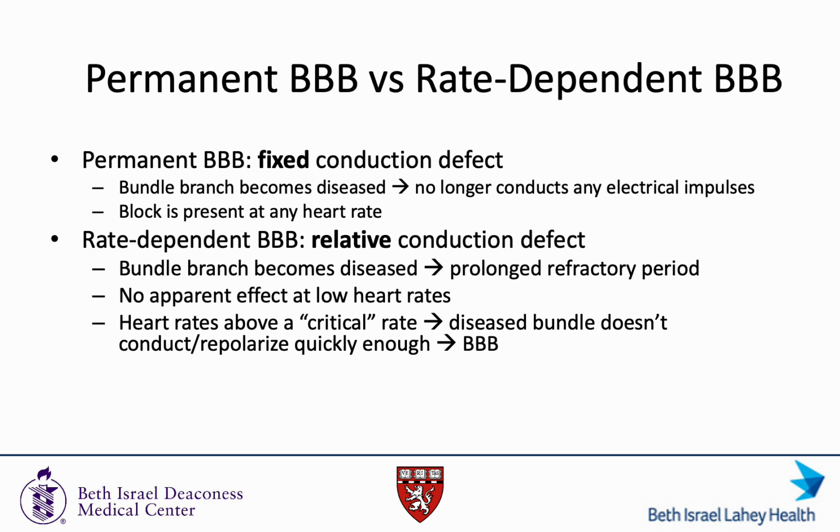This distinction is important because patients may enter SVT and develop newly widened QRS complexes. Therefore, you can't automatically rule out a supraventricular rhythm in a patient with a wide complex tachycardia that has normal QRS complex width on a non-tachycardic EKG. In all patients with a wide complex rhythm, looking at previous EKGs is critical.